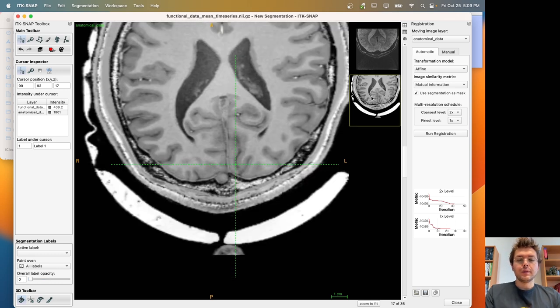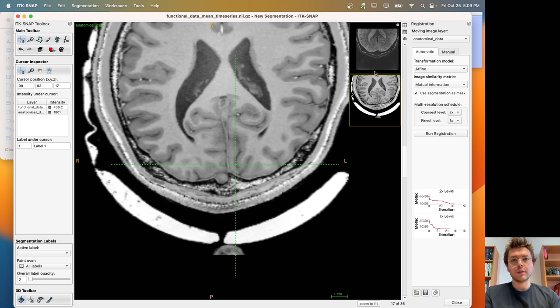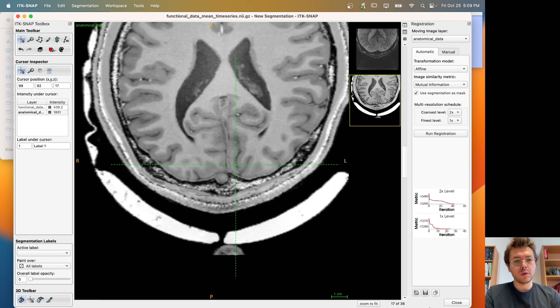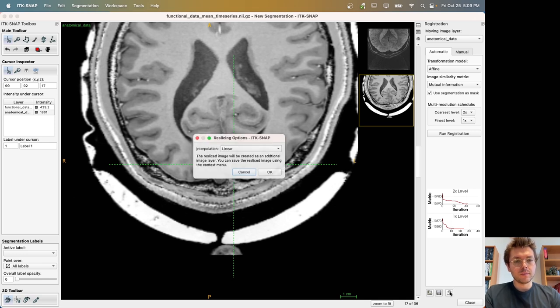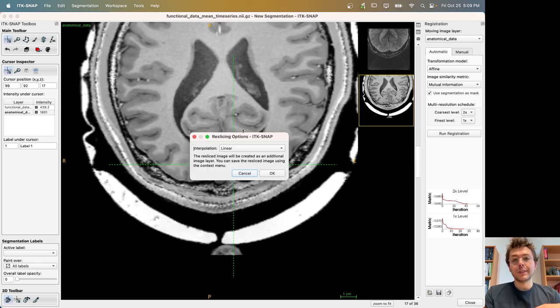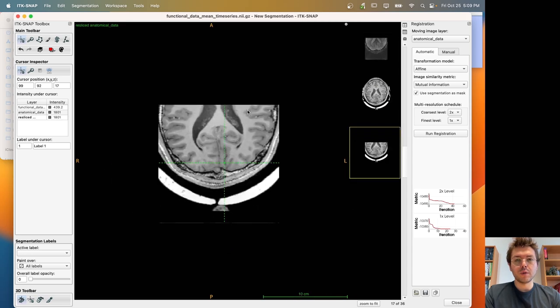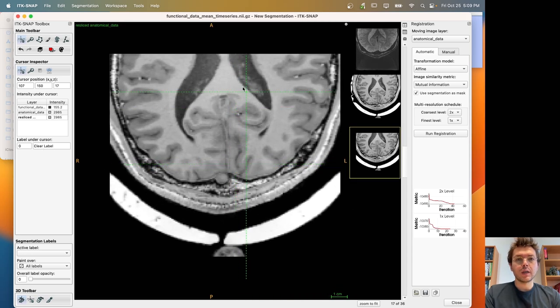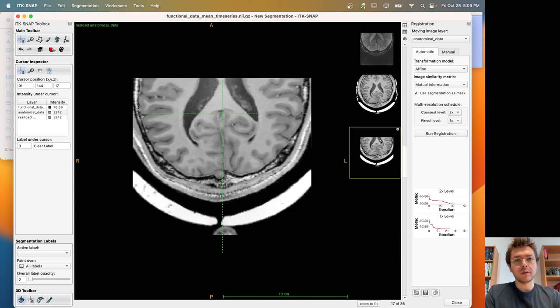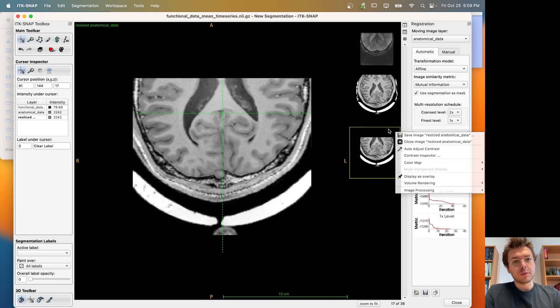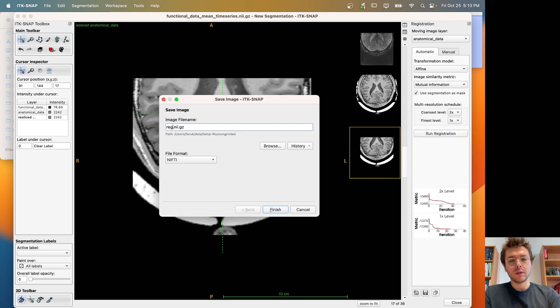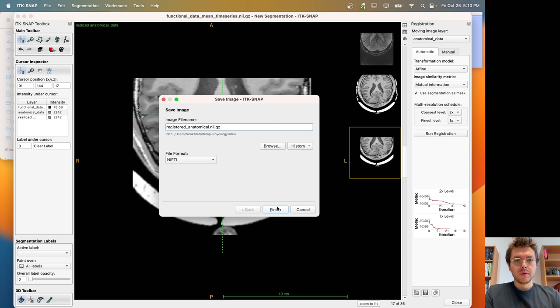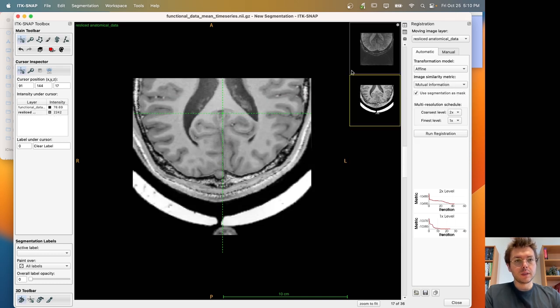But now, the program just found the registration, which is the affine transformation matrix. And the data is not really changed yet, in terms of changing the NIFTI data. To do that, we need to go on the lower right side of the screen and click on this stack of squares button. This will basically re-slice the anatomical data using the registration matrix. I'm going to just use the default option here. Click OK. And see that we have already re-sliced our anatomical data in the same data array as our functional data. So this image now needs to be saved. We can do that by clicking to this little arrow button here, and then say save image. I'm going to call it registered anatomical. Finish. And now we can close our registration tab.